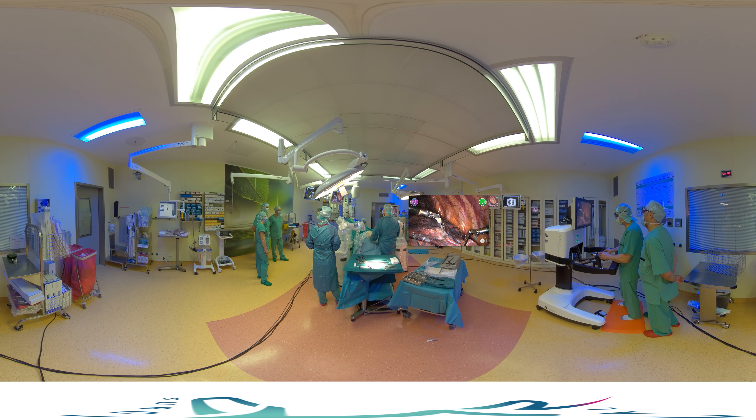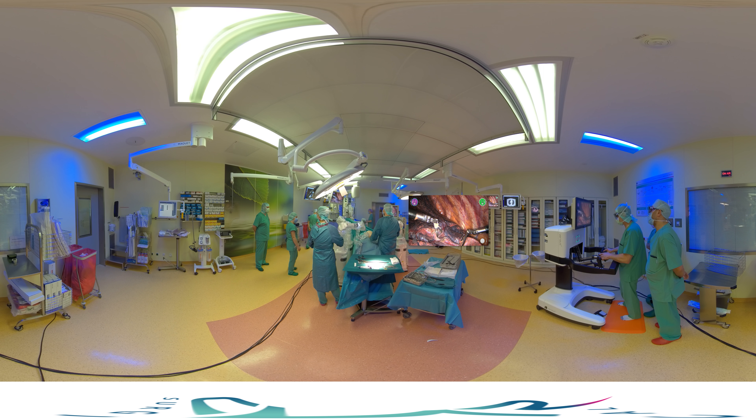I usually perform the operation in a standing position as I find it more comfortable and ergonomic, although some of my colleagues prefer to operate in a sitting position.